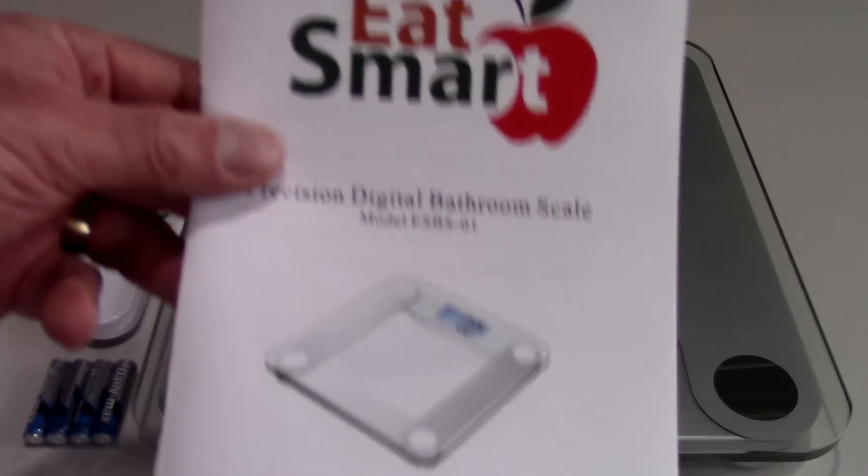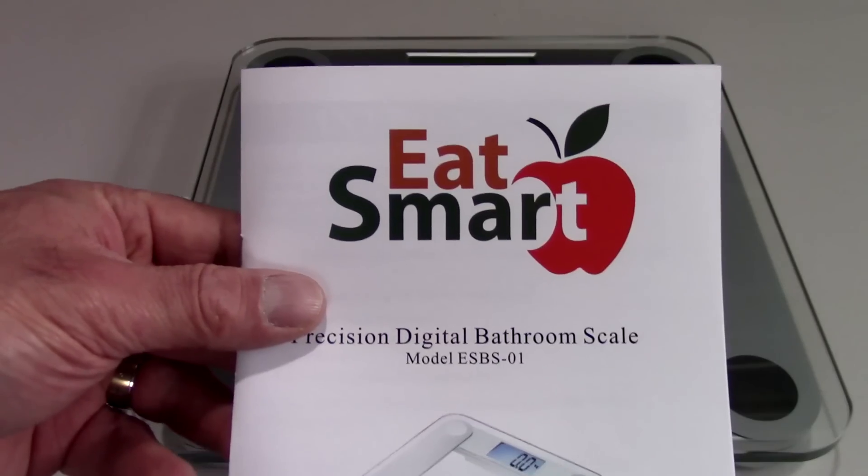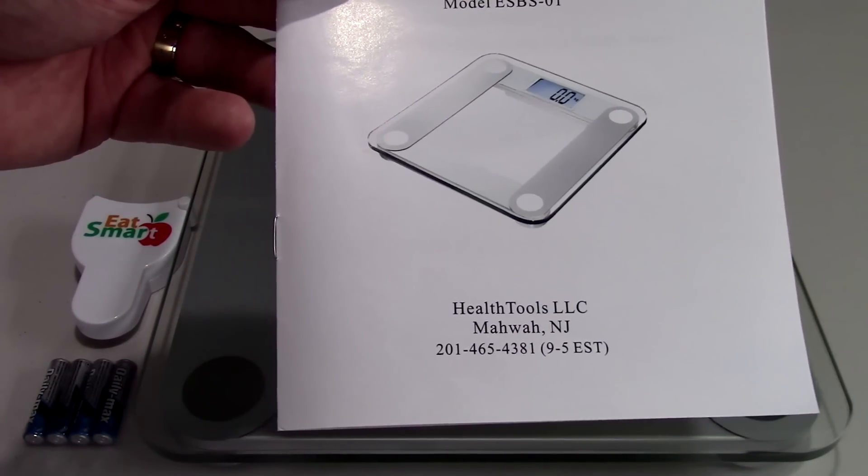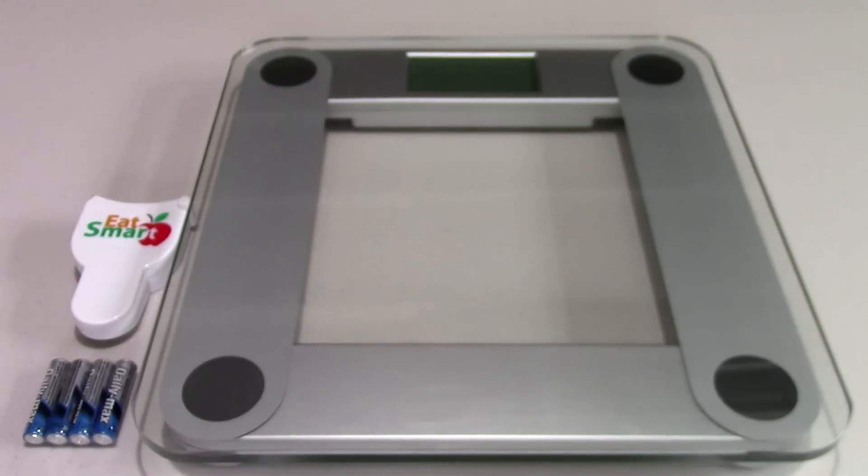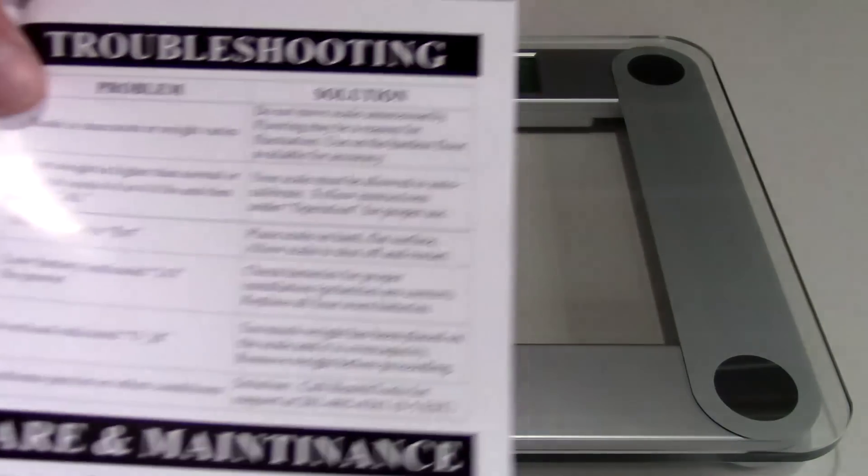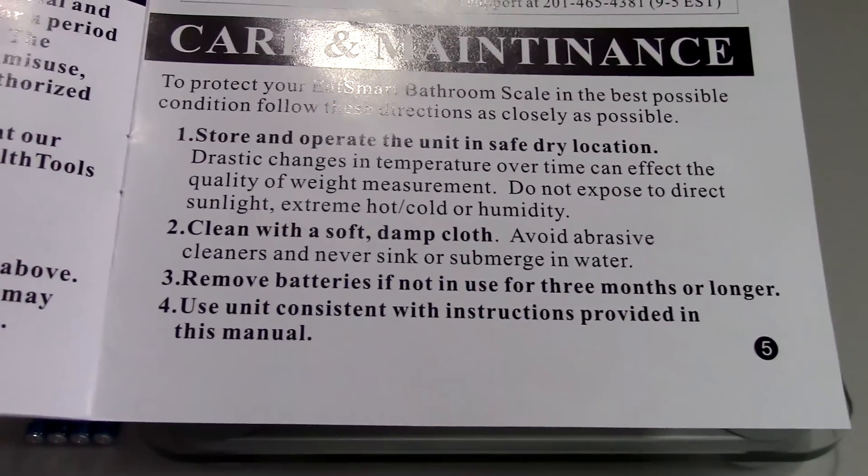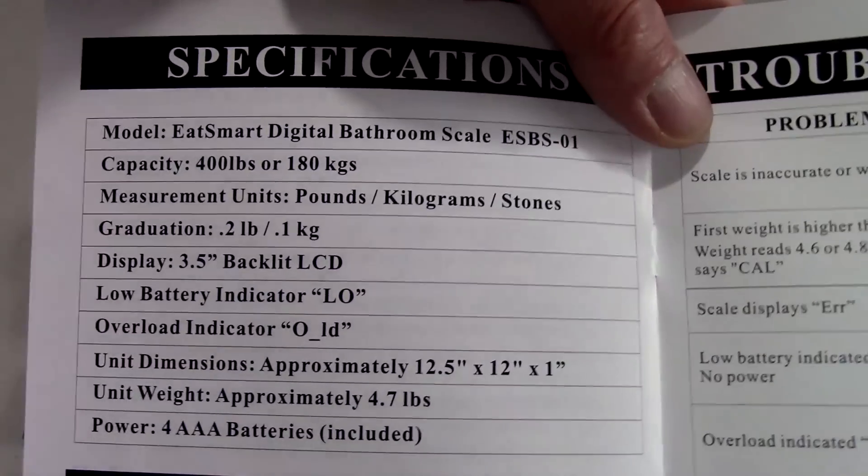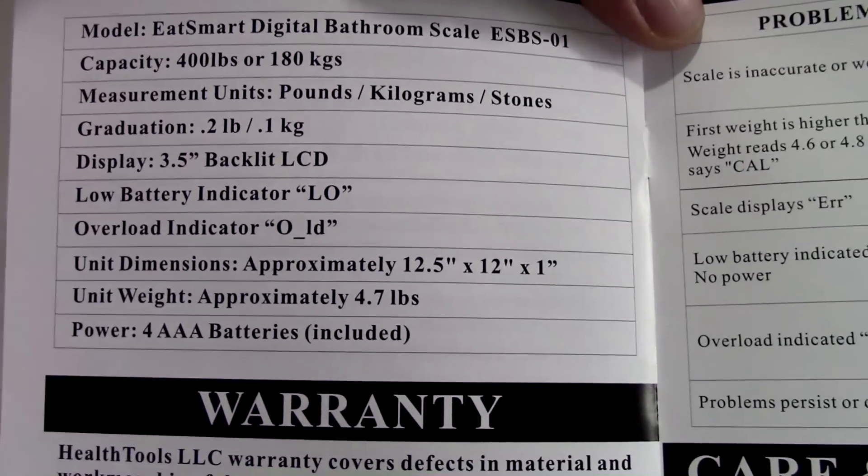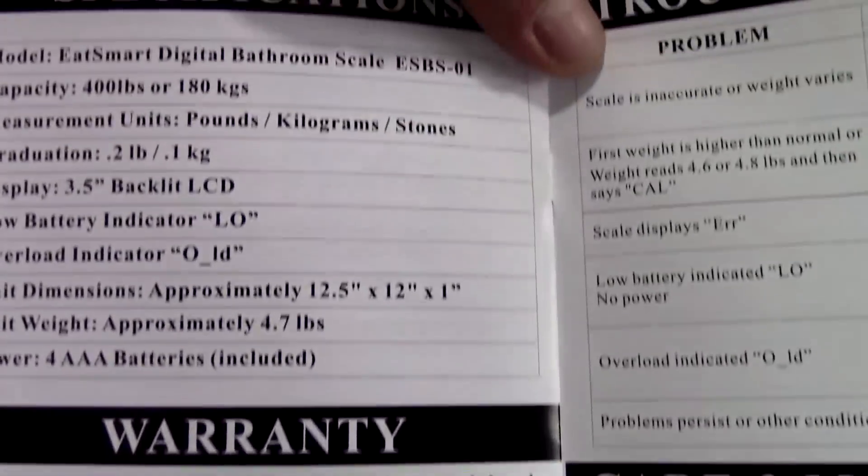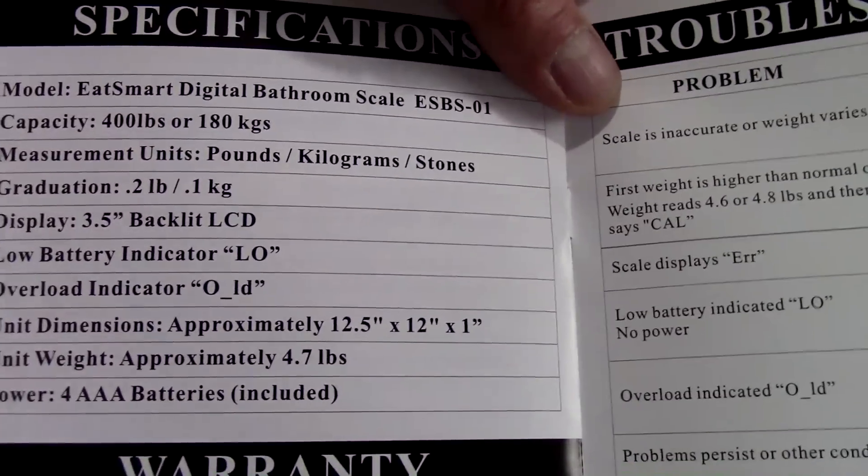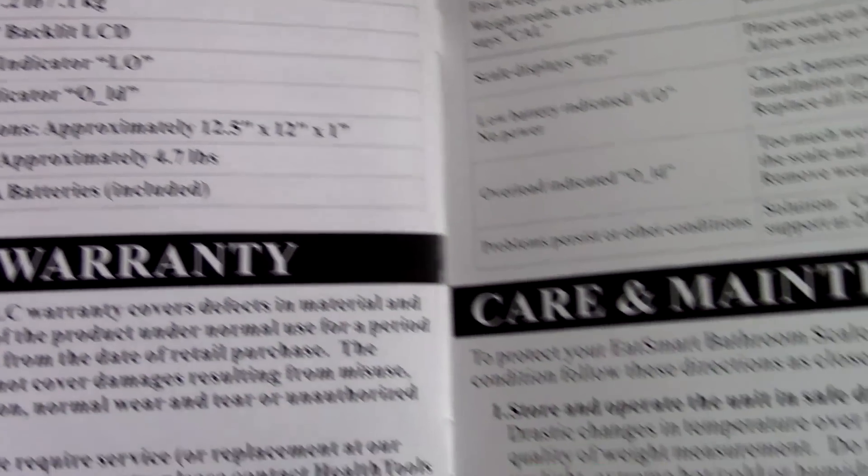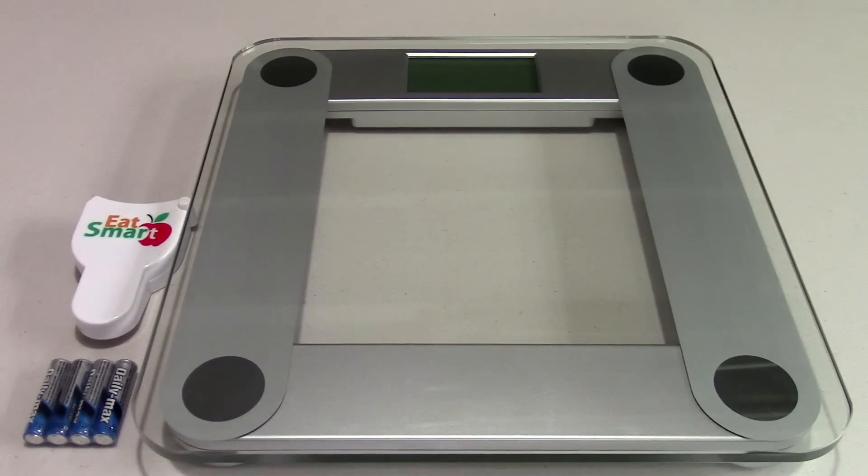Right here is the owner's manual. Nothing too fancy about this, in fact it's only five pages long. And we'll go ahead and zoom in here on the specifications. You'll see right here the capacity is 400 pounds. That's a pretty stout scale right there.